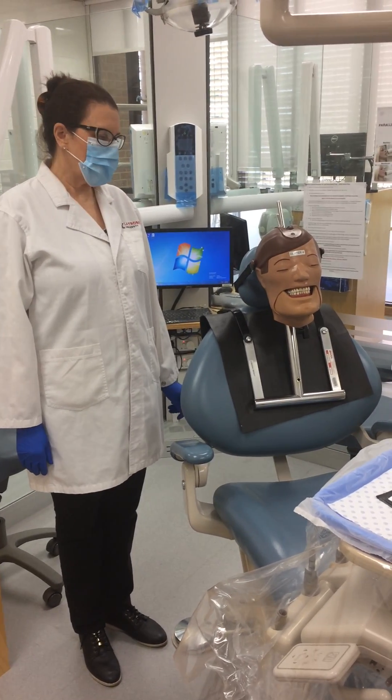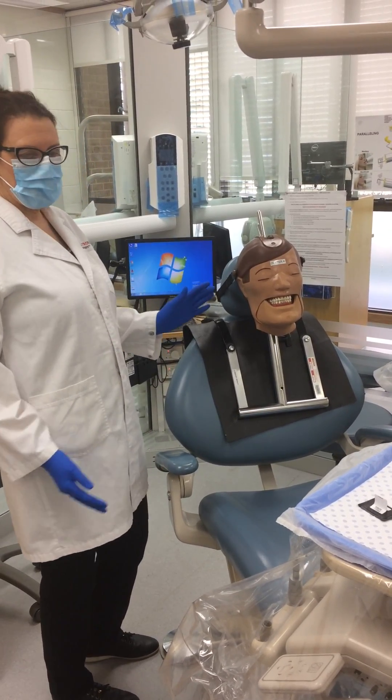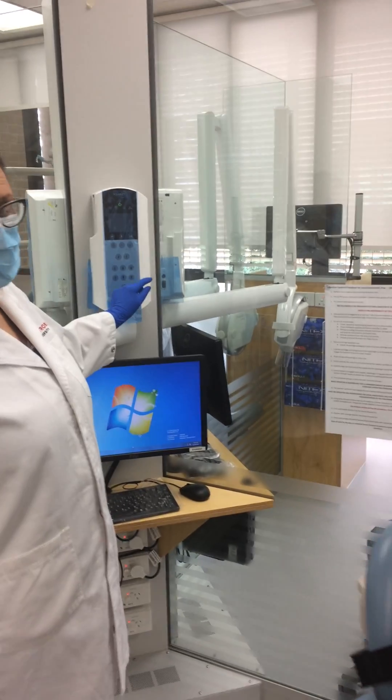This is a demonstration on how to take a radiogram and the processes involved in doing so. You've got the patient in the chair, they're in the right position. The first thing you will do is check that you've selected the right exposure.